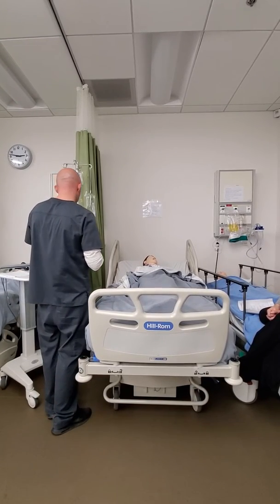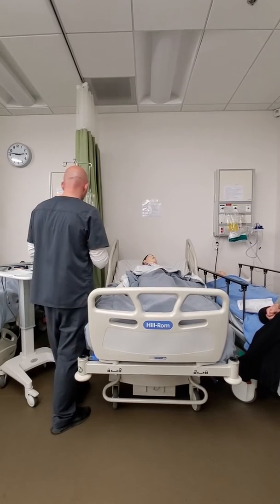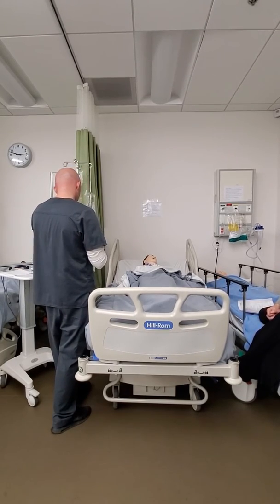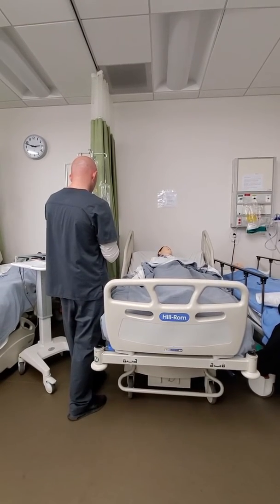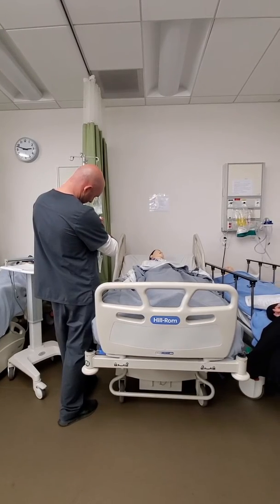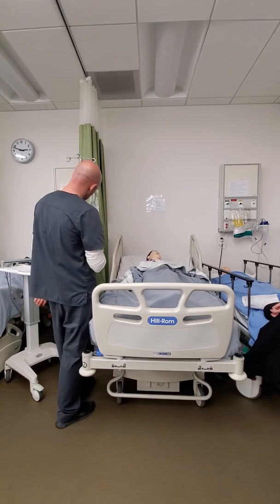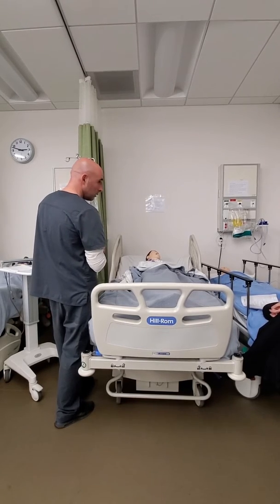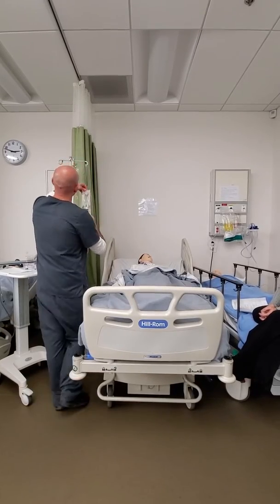So once I have that, because this is compatible with this med, I can open this line just to fill up this chamber. What do you guys think about that? Why not? You would want to put the medicine in there. Yeah, so you'd wanna flip it and hang it, so that it's the higher one. And then you'd squeeze the chamber, I believe.